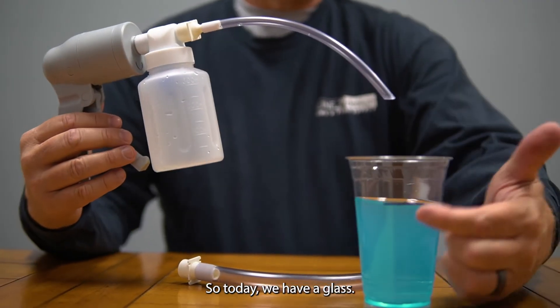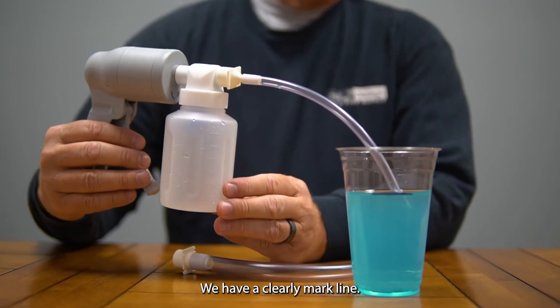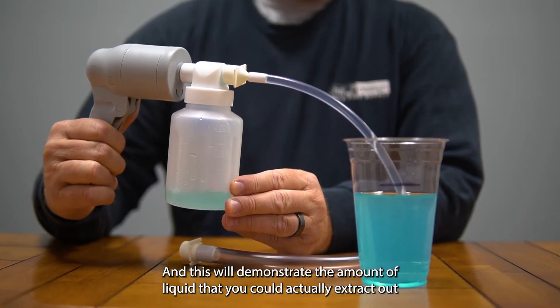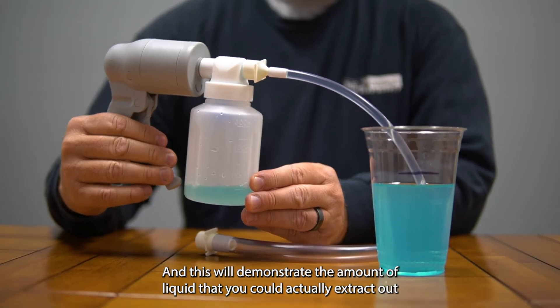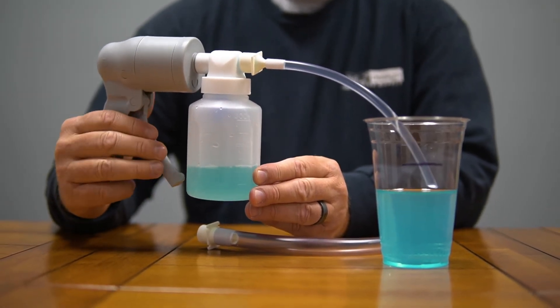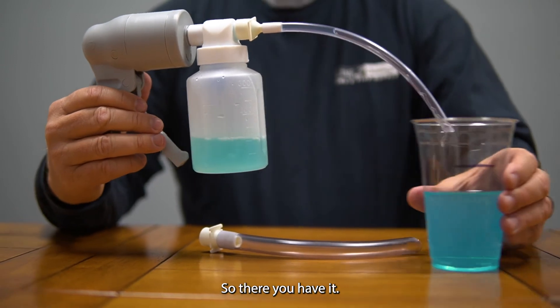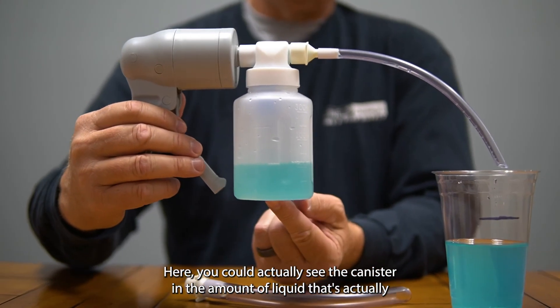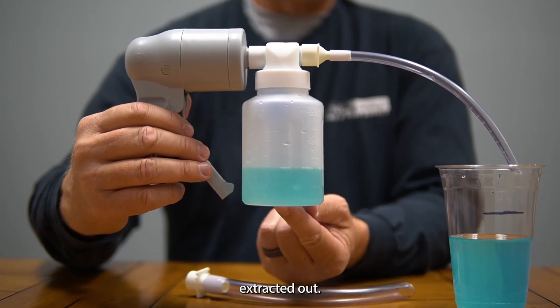Today we have a glass with a clearly marked line. Once we stick it in, we'll do about five pumps, and this will demonstrate the amount of liquid that you could actually extract. So there you have it — you can actually see the canister and the amount of liquid that's been extracted.